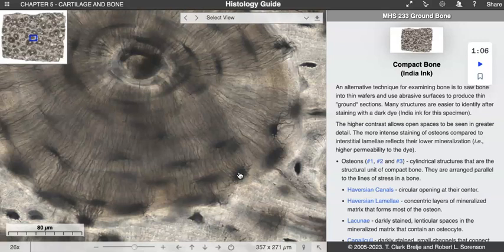And then what you also can see, and the stain collects, are all these little hairline fractures, right? You can see all these little lines here, and those are all referred to as canaliculi. And again, when you see that suffix of uli, iole, ule, it really means a smaller version of something else, right? And so these canaliculi are little channels that lead from the vascular flow here to each of the lacunae where the cell would be housed, so that we can have molecular exchange. You have to think like all of this matrix. So all of this is bone matrix in here.